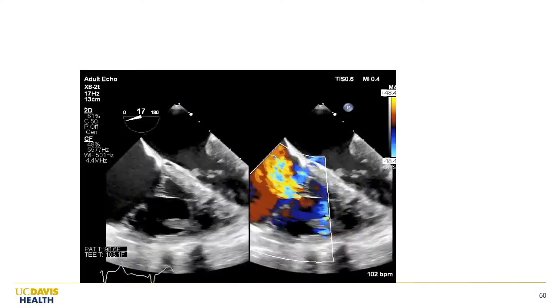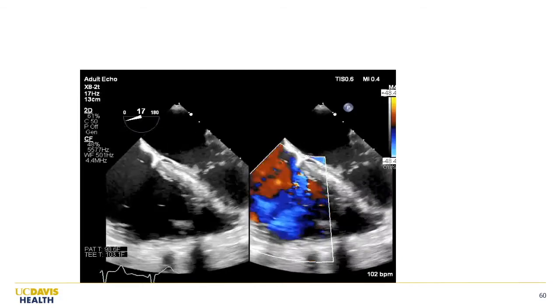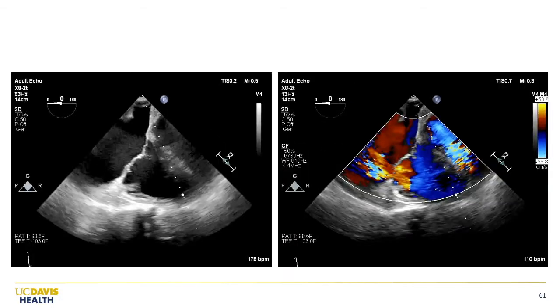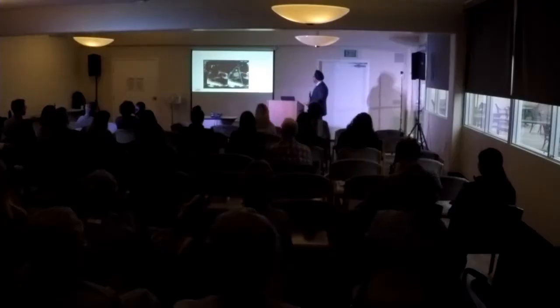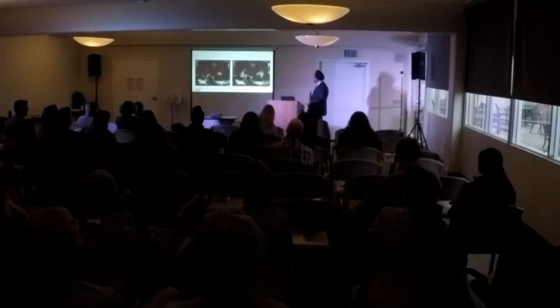Here's what the transesophageal echo looks like. You see a lot of this mosaic color pattern, and that's indicative of the tricuspid regurgitation that we saw in this patient. Here's some additional views. It's called a deep esophageal view. And again, this is a really important view for us, because it allows us to stare at all aspects of the valve coming in and out of plane here. And this is just a very, very, very broad tricuspid regurgitation jet.